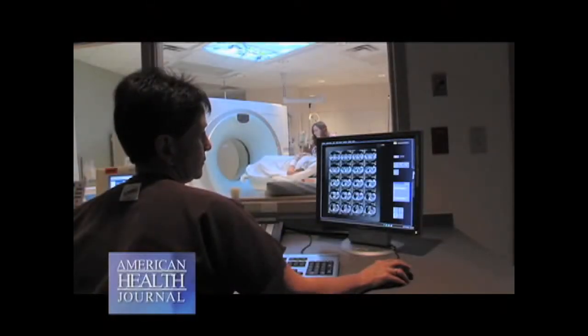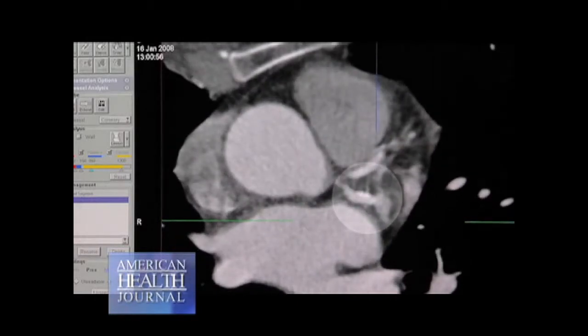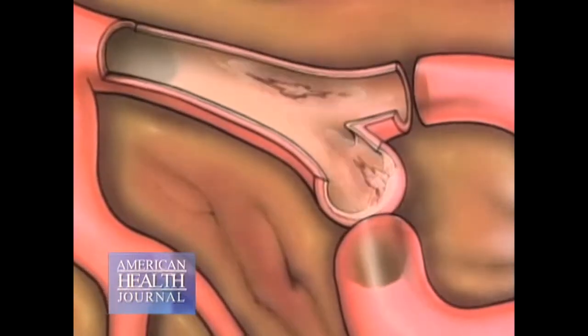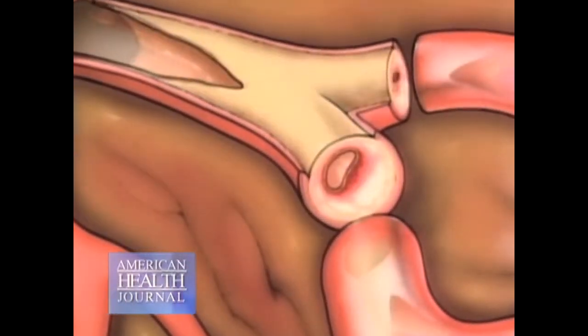With our original test, the calcium score, that's more of the cement, the permanent stuff. Those are the bones that are building up in the coronary arteries, making it hardening of the arteries. That's really where the term atherosclerosis came from, hardening of the arteries. That's due to the calcification. But what we can see now with the CT angiogram is the soft plaque, the early plaque. And we've now shown in a recent study that you can actually reverse the soft plaque, that you can suck the fats out of the artery and make the artery better.